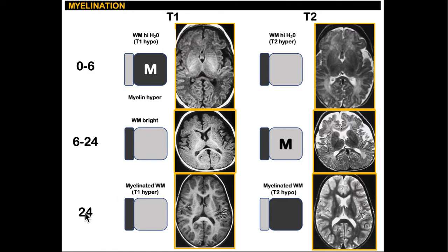At 24 months, myelination is now adult-like or near-adult-like, comprising T1 bright and T2 dark white matter tracts. Notice also that the subcortical U fibers are also myelinated at this stage, unlike in the earlier stages.